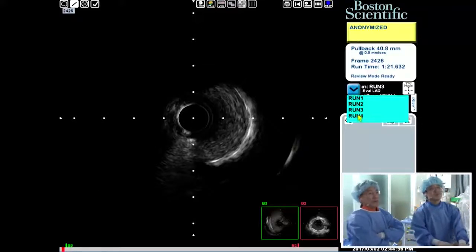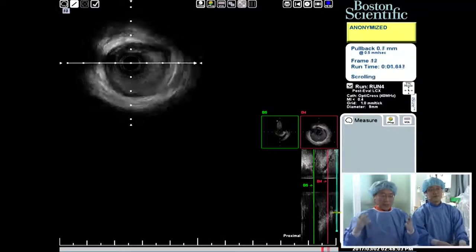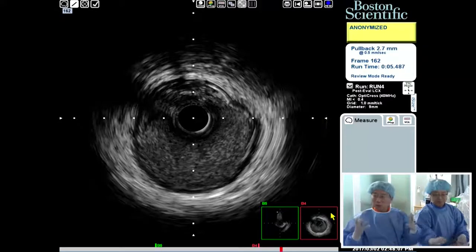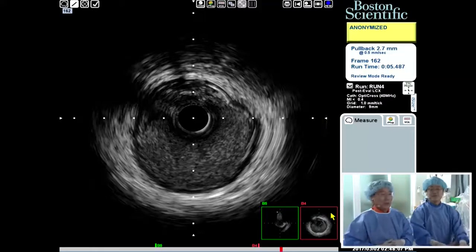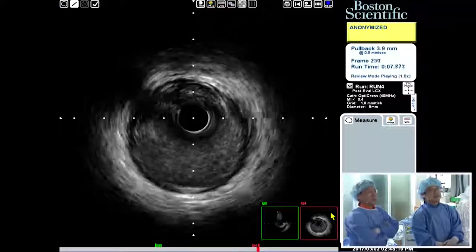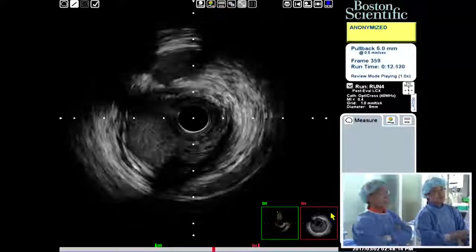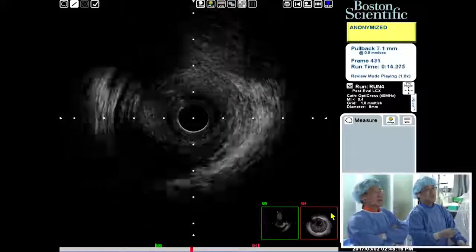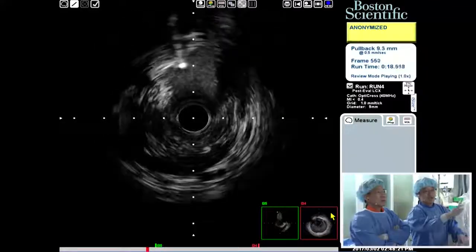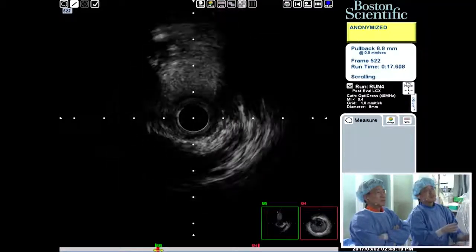Yes. Okay. So based on the angiographic findings, we did IVUS in all branches, and we have a better understanding of what the characteristics are inside the vessel. Let's start with the big vessel, the circumflex. At first, before pre-dilation, the IVUS did not pass, and after dilation we can see a very tight, huge block. Can you show again the circumflex ostium? Yes, the lesion length is not so long.